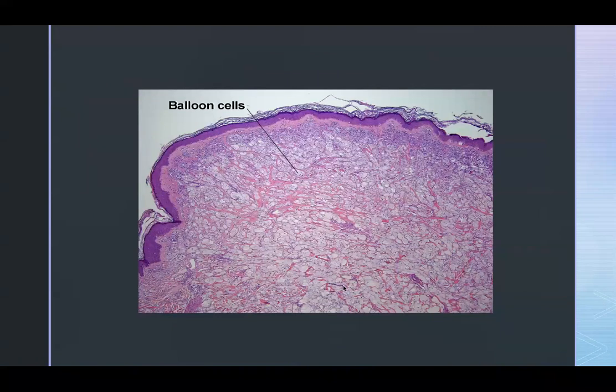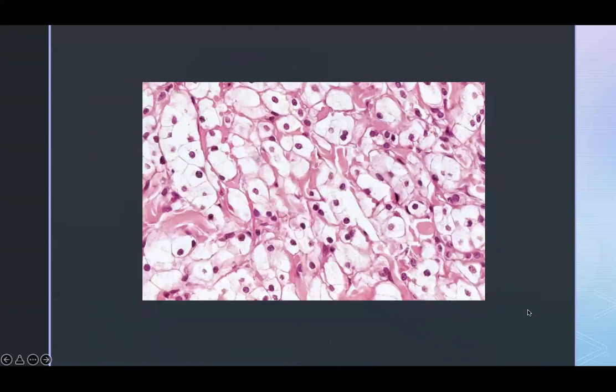You've got these abundant epithelioid to ovoid cells with large, clear cell cytoplasm, and it's a ballooning in terms of the architecture. So that is the balloon cell nevus, and these are actually melanocytes. At the top, you can see that these look a little bit more like melanocytes, but then they have this transition into a more ballooned up cytoplasm.